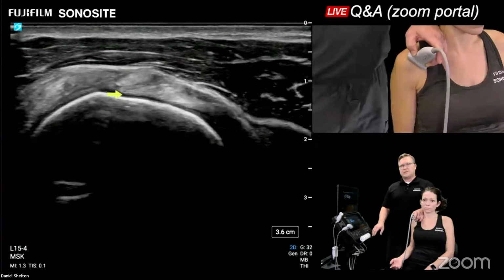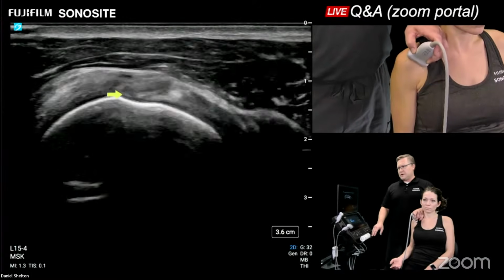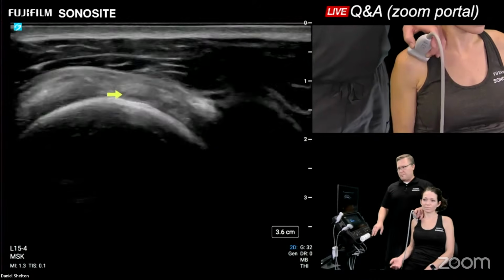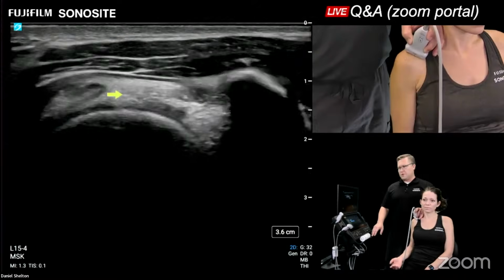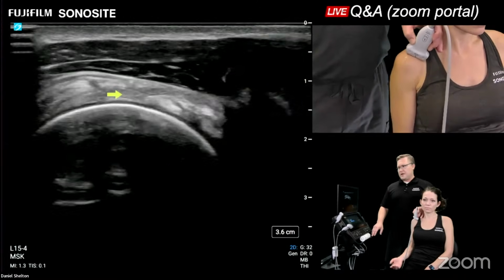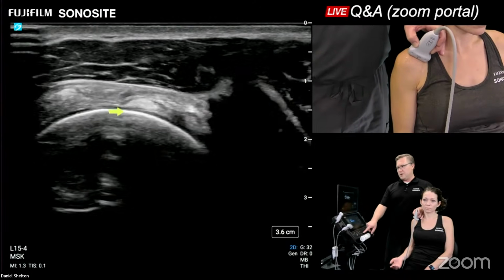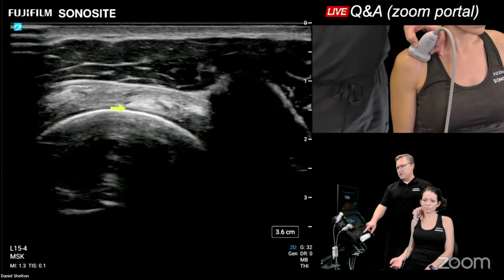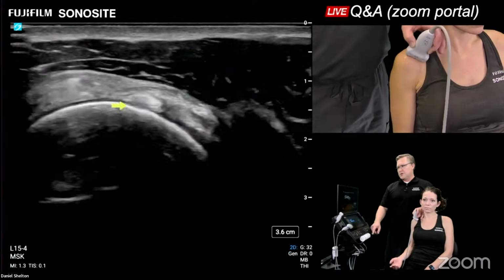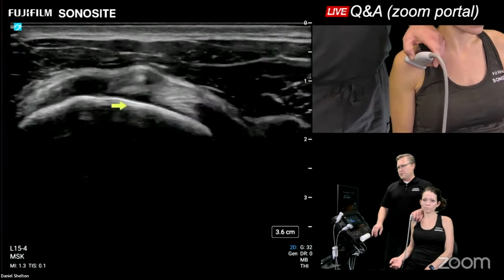It's a good maneuver to practice. So if it's not something that you see a lot in clinic, find you a healthy volunteer or a model and stay up by the acromion level. So here we have that coracoacromial ligament. Find the biceps as far north, staying perpendicular to the humeral head. That's what's most important right there. See the bright white cortex of the humerus, and we have the anechoic cartilage. Then we have the biceps. If your bone is nice and crisp, so will your tendons be.